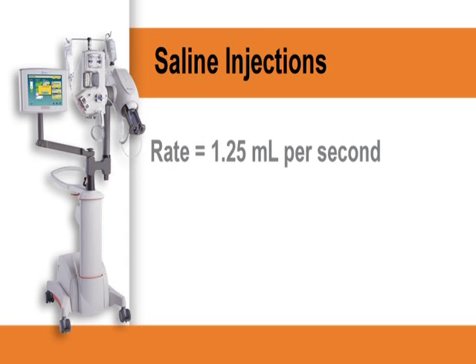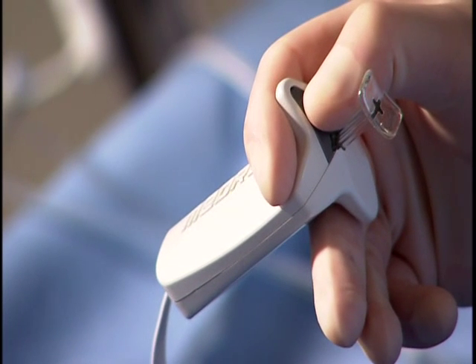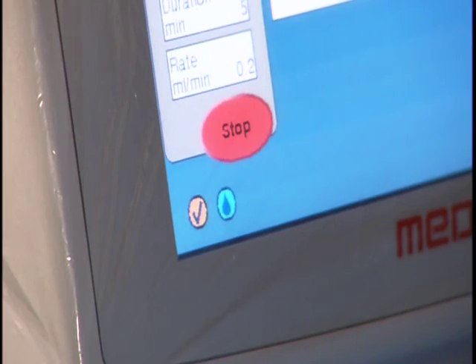Saline injections can be performed at a rate of 1.25 milliliters per second and are initiated at the hand controller by pressing the gray button. Saline can be injected at any time, except when contrast is flowing.